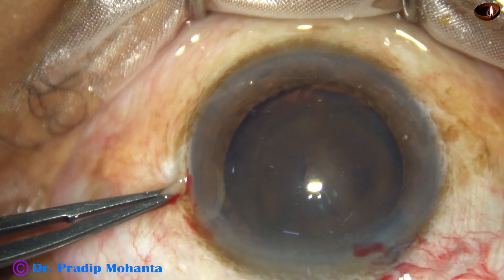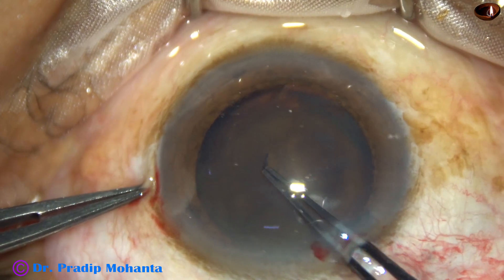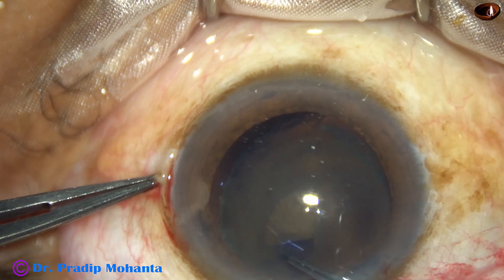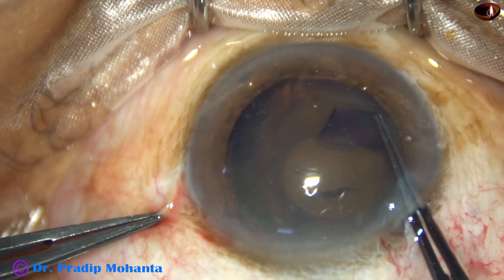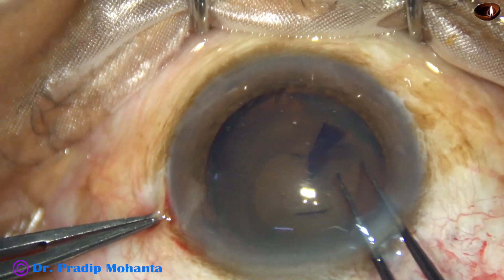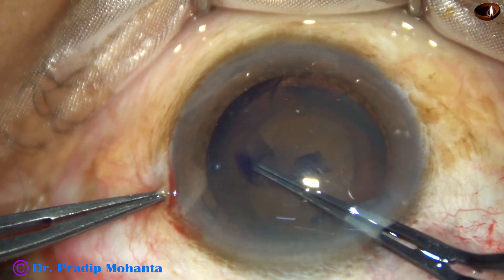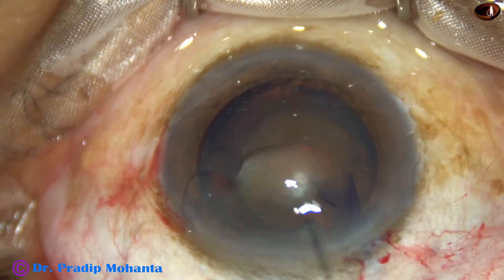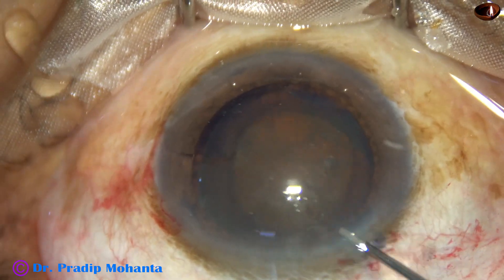After staining the capsule with trypan blue dye, the anterior capsule is torn at the center with a 26 gauge bent needle, and with the help of a Utrata forceps, a small rhexis is done — a 4.5 millimeter rhexis — because I have to use a capsular tension ring, and if the rhexis is large, it will be difficult to apply the capsular tension ring.